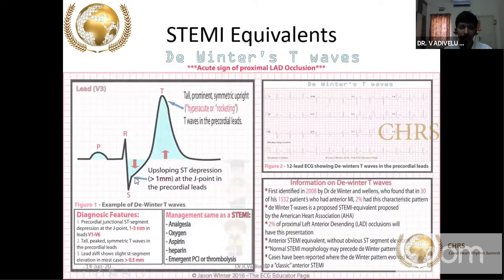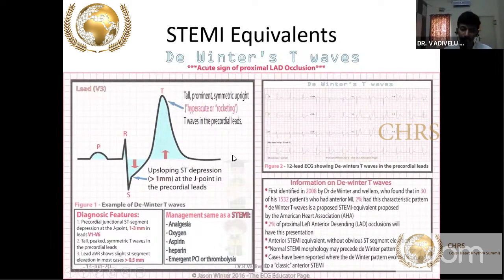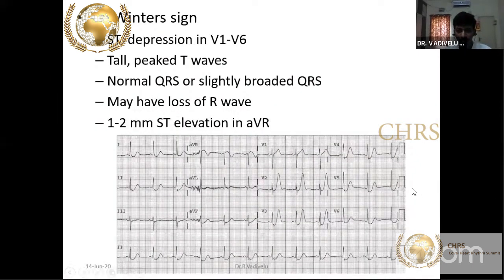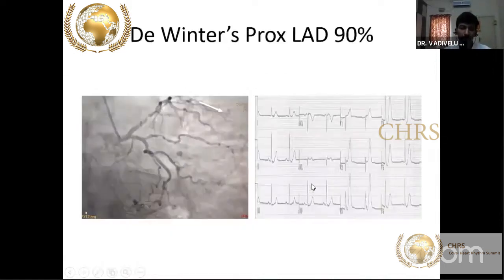De Winter described a pattern with J point depression and upsloping ST segment depression of more than 1 mm, along with a hyperacute or rocket-like T wave — this is De Winter sign. It is very classical of LAD occlusion. You can see this in V2 to V3 — J point or ST segment depression with an upsloping pattern and hyperacute T wave.